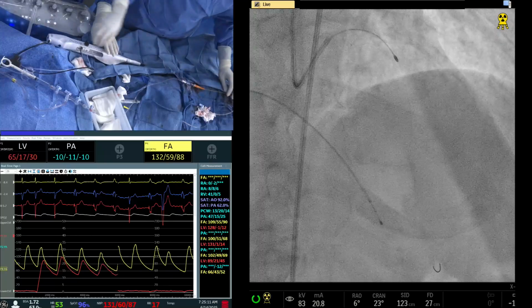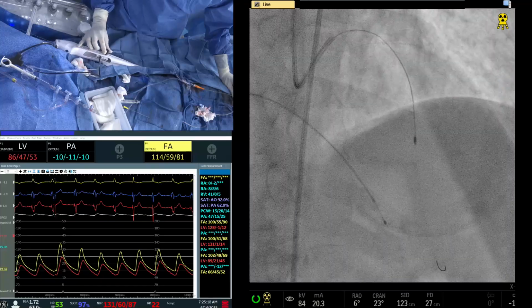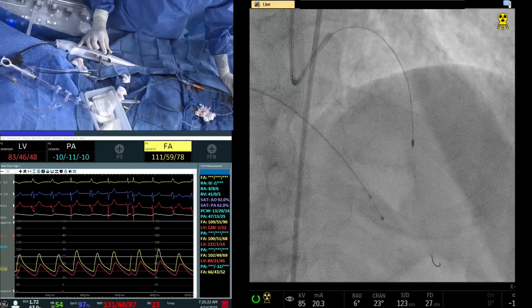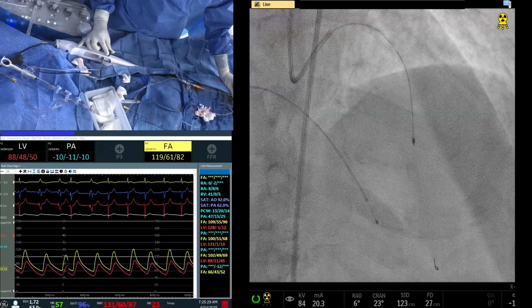Get a 2.5 by 20 high pressure balloon also. Now we are ready. This will give you enough 90 centimeter. So we actually see a heavily calcified lesion, that LAD also very further down. Yeah, good. Beautiful.